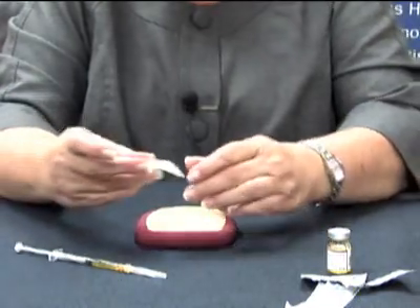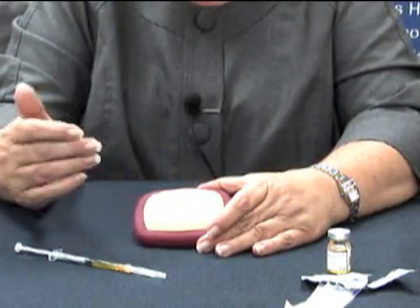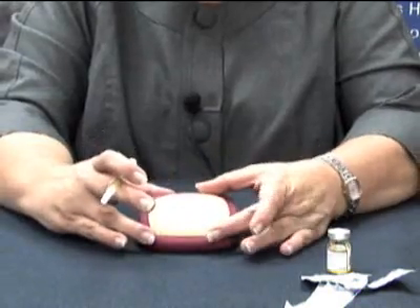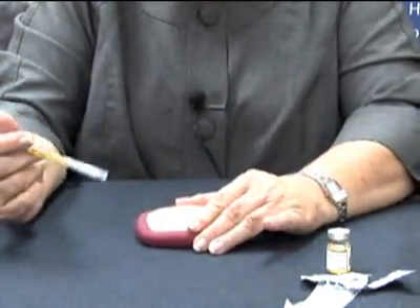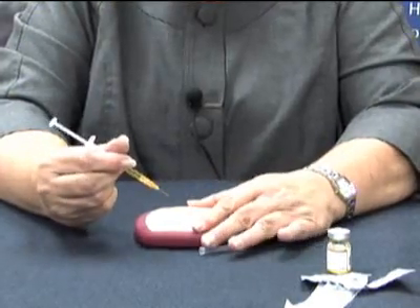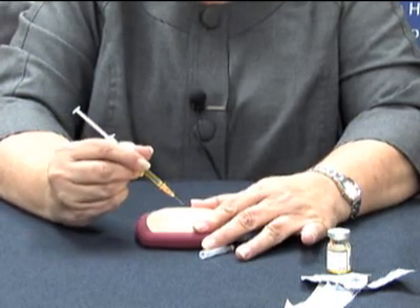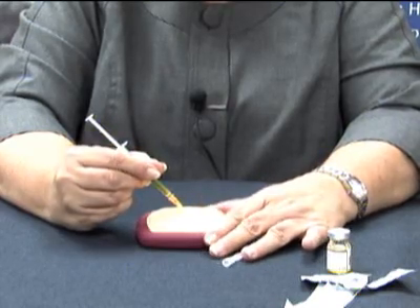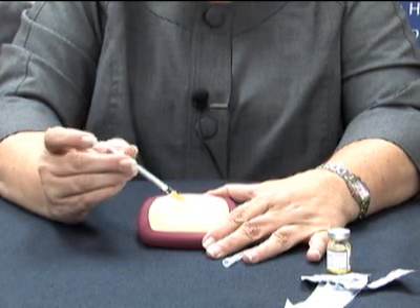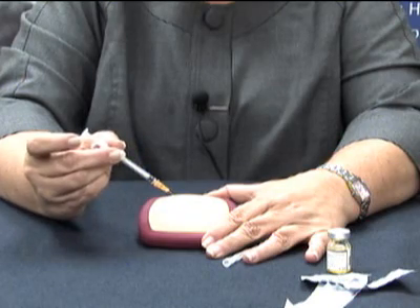Let that completely dry. Sometimes if the alcohol is wet, there can be some stinging once that needle pierces the skin and pushes a little wet alcohol underneath the skin. You are going to grab a hold of a piece of skin where it has been cleaned. Hold your syringe much like a dart, and when you enter the skin you are going to go in quickly but firmly. Once you have entered the skin, you are going to depress the plunger evenly — you can do it over about three seconds. Once all the medication has gone in, you remove the syringe in exactly the same direction.